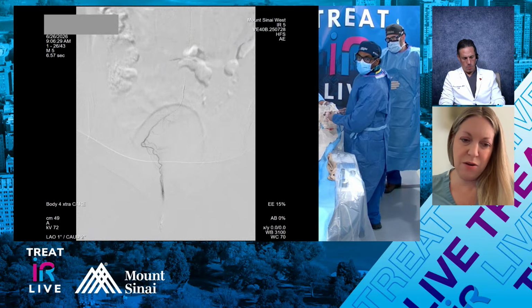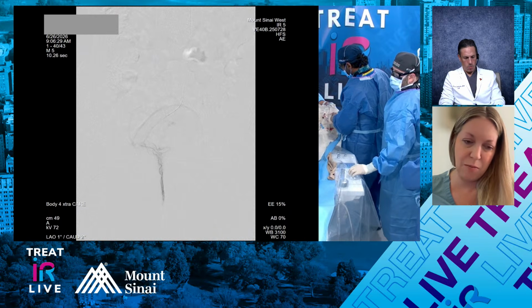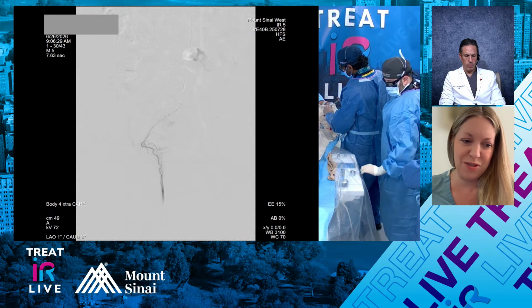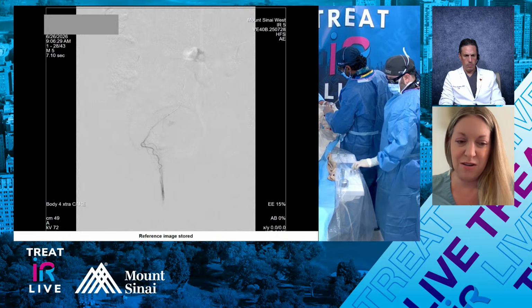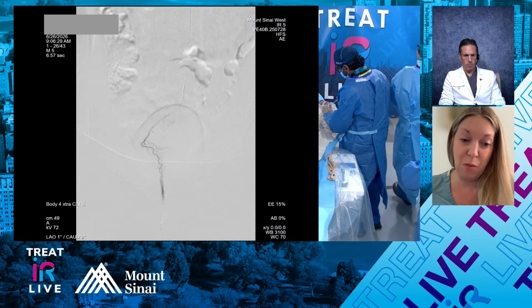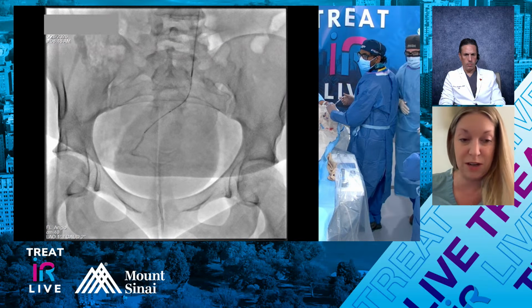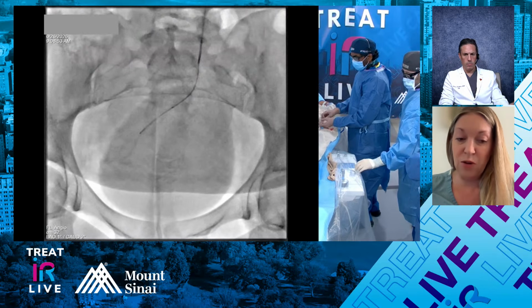Yeah. So I do a very small amount of very dilute particles, just to decrease that blush that we see in the corpus cavernosum recti. And again, we don't want them getting anal pain syndrome and things like that. There was a study where they did stasis with only particles, and there was definitely more pain with that kind of volume. Now, no ulcer, no ischemia happened, but they definitely had more pain, especially with the smaller sizes. So I just do a very, very tiny amount.